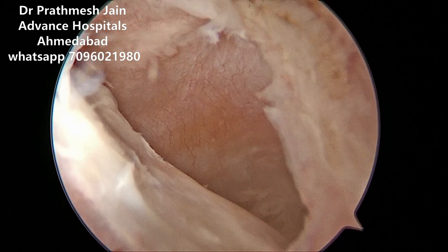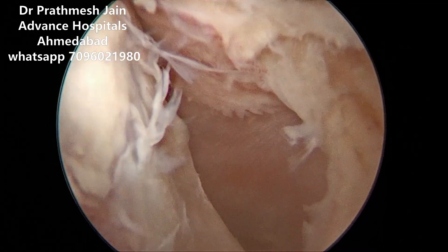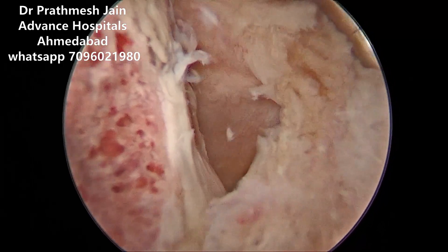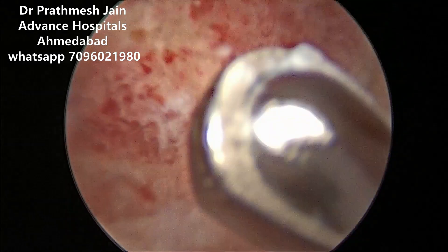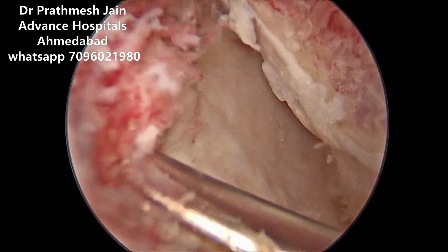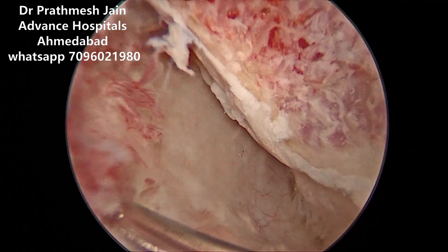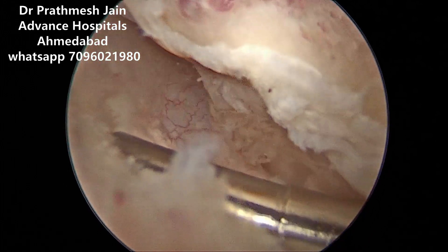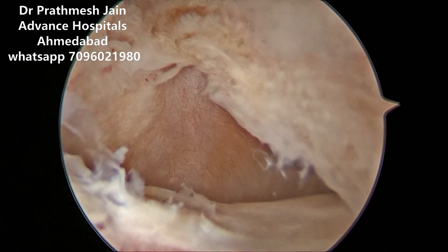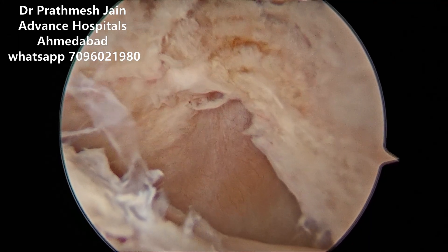Once you get good visualization, hip arthroscopy becomes a very rewarding surgery in most cases. This is the anterior neck, anterior head — this is the resected part of the CAM. You need to make a resected section of about two to three centimeters and about five to eight millimeters deep for the CAM resection. This is the posterior part of the neck. You can see the chondral flakes moving around, which I was discussing — these are consistent with synovial chondromatosis. You can also see the posterior vascular elements in the posterior capsular tissue. This is the anterior region of the zona orbicularis, the peripheral compartment of the hip joint.